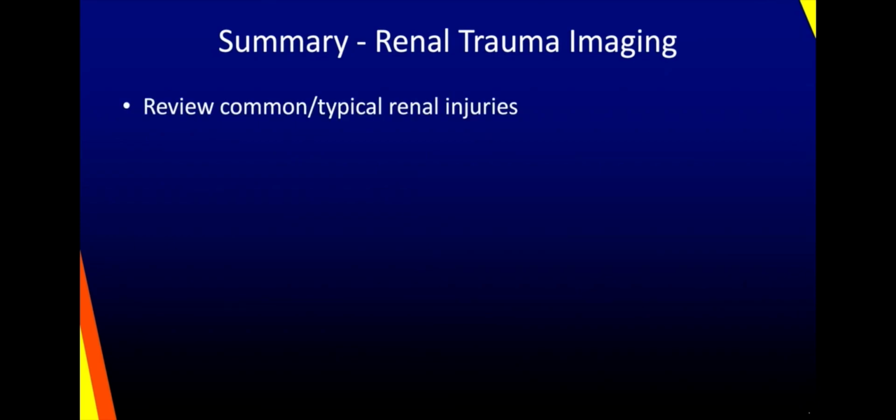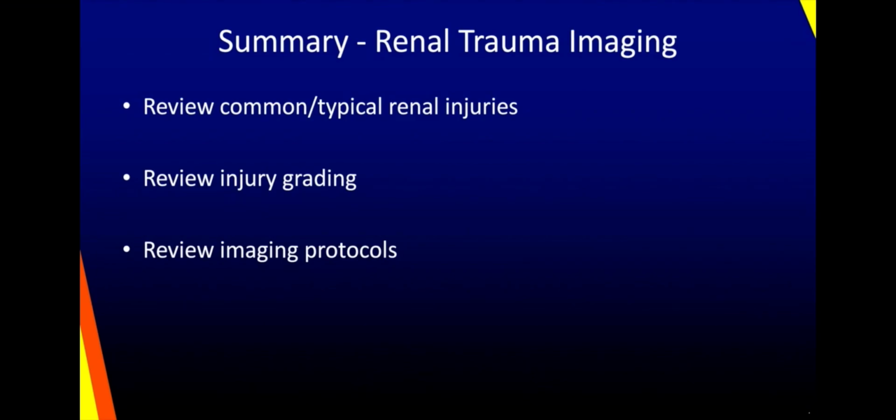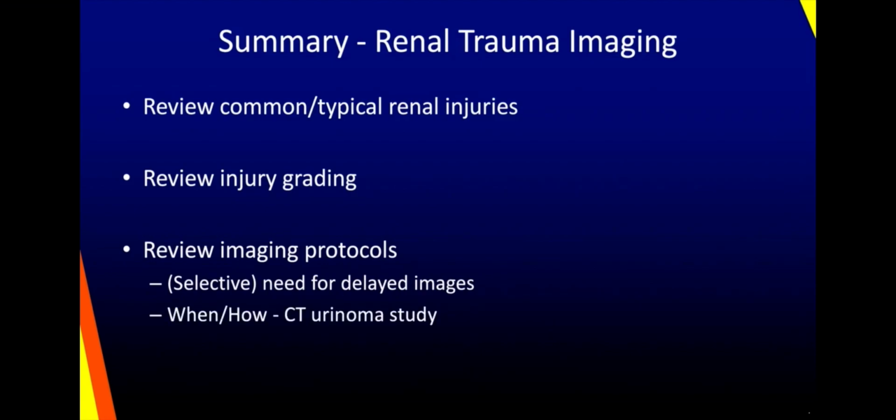So in summary, we've reviewed the common and typical renal injuries. We've reviewed injury grading. We've reviewed imaging protocols and the selective need for delayed images and when and how to perform a CT urinoma study. And we've spent some time going beyond the basics.